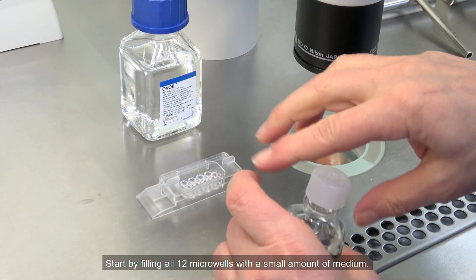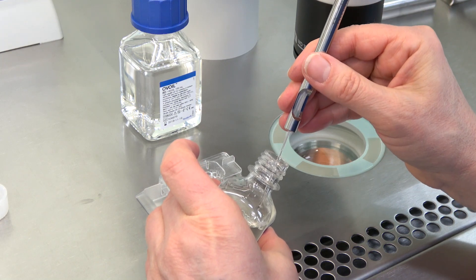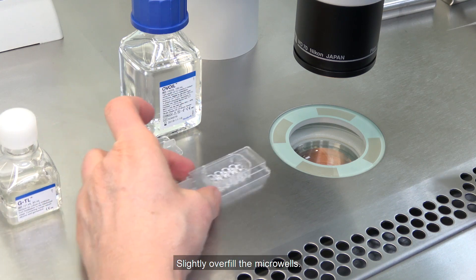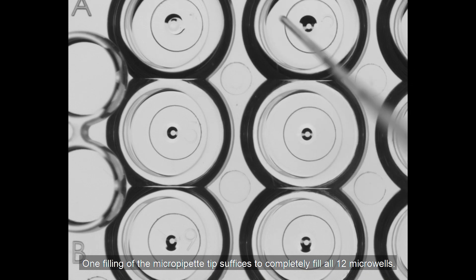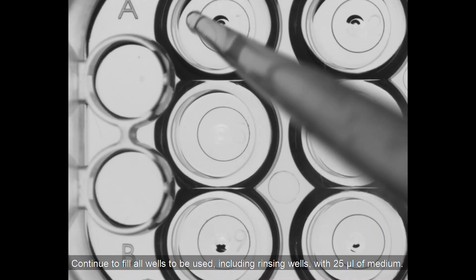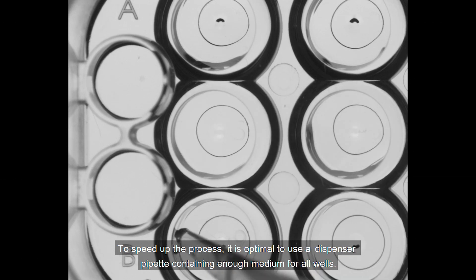Start by filling all 12 microwells with a small amount of medium. Slightly overfill the microwells. One filling of the micropipet tip suffices to completely fill all 12 microwells. Continue to fill all wells to be used, including rinsing wells, with 25 microliters of medium. To speed up the process, it is optimal to use a dispenser pipet containing enough medium for all wells.